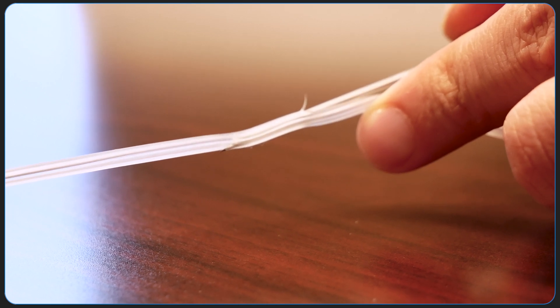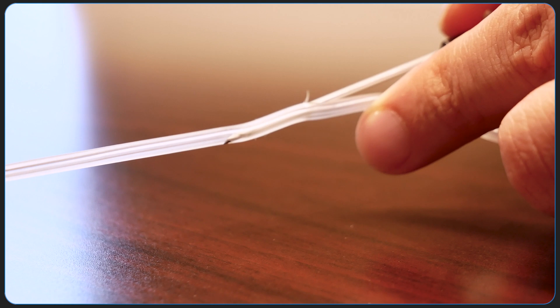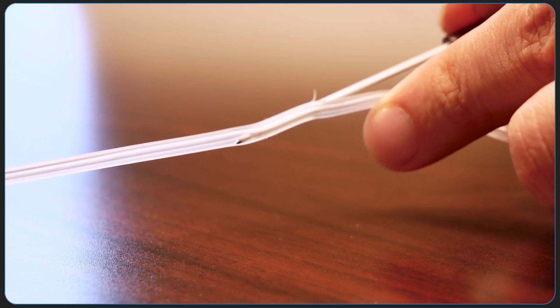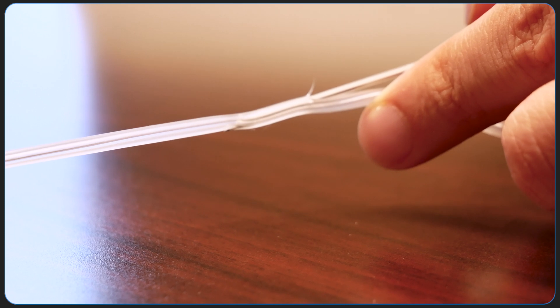And it doesn't take very much angle because that bottom portion is what does the cutting. Now this one's already a little bit dull because we've used it a couple times already. But that does not take much.